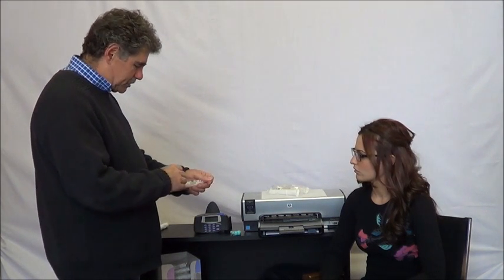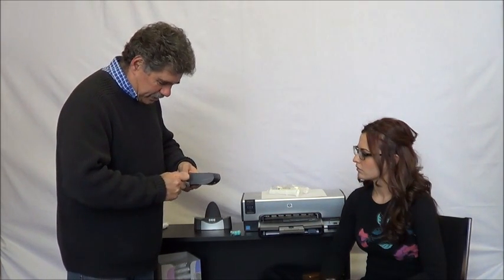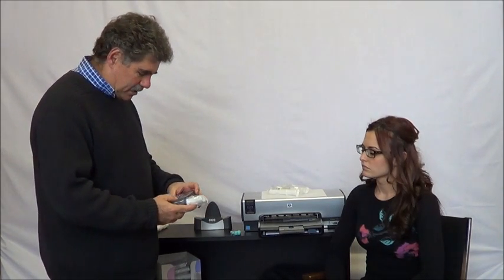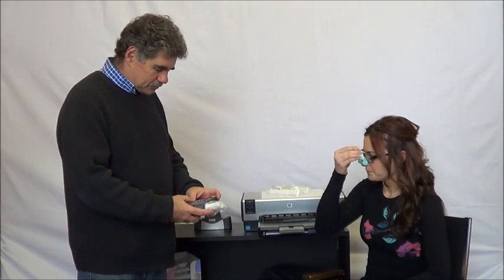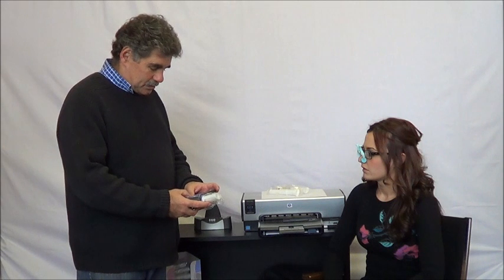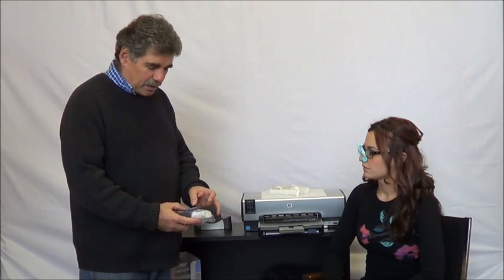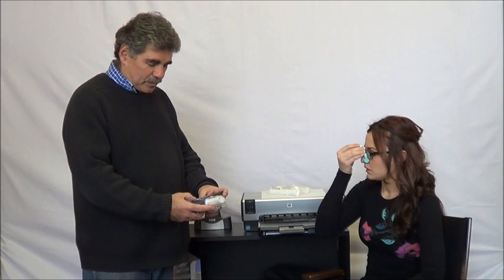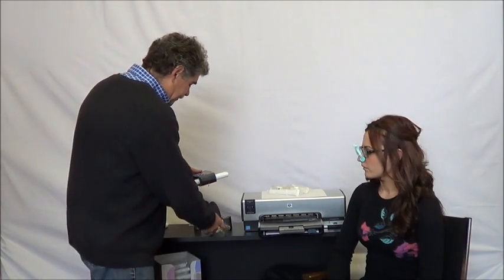To do that, we need to install a new spirette into the device. I'm going to leave this bag on here — you'll see why in a moment. Insert it all the way in; I've matched up the arrow on the spirette and the barrette. I'm going to ask you to put a nose clip on so you don't leak any air out your nose. When I press enter, it asks for room temperature, defaults to 71, I press enter. It says 'block spirette until prompted to blast out,' meaning leave the plastic bag on the spirette while pressing enter. A few seconds later it says 'blast out' and we're ready to go, so I remove the bag and hand you the spirometer.